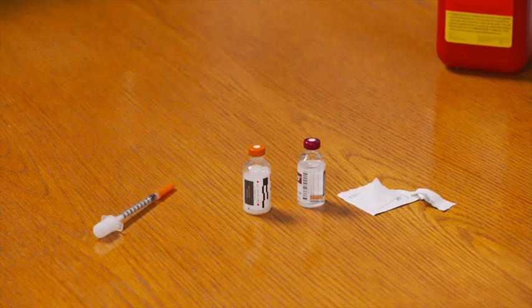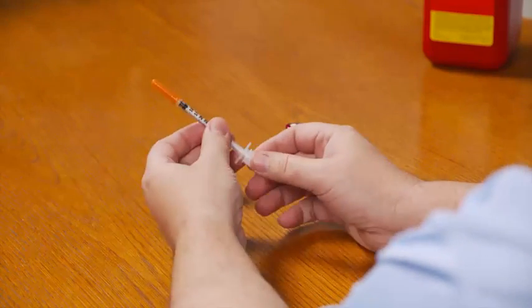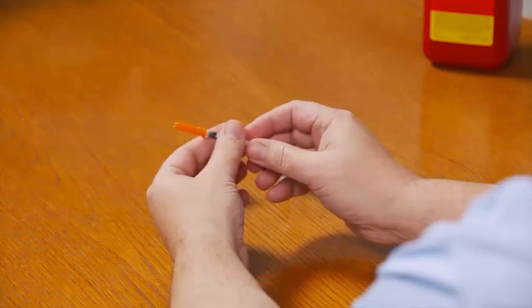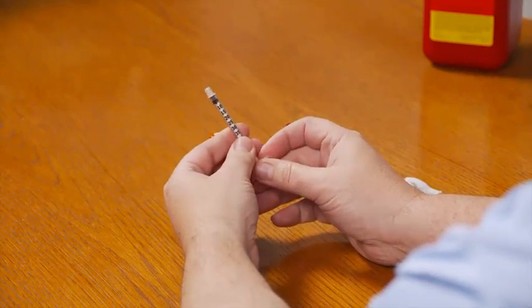Now, when you mix insulin, the first step is to inject air into each bottle equal to the amount of insulin that you intend to take from each bottle — this makes it easier to get insulin into the syringe. To get started, twist and remove the white cap from the end of the plunger, then pull the orange cap off the needle, making sure to pull straight off to avoid damaging the needle.